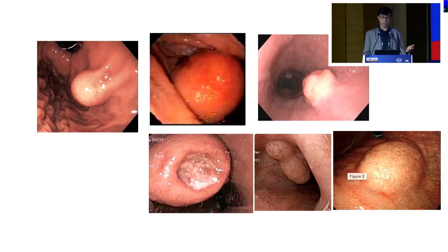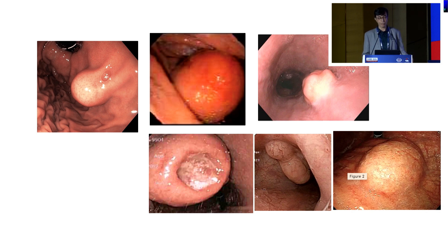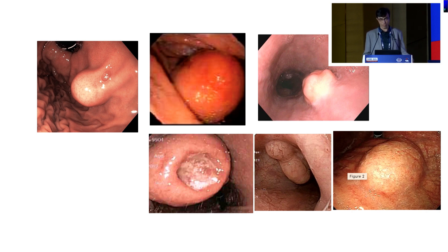There are other SELs shown in this photograph which you have to evaluate. The first one on the left looks like varices but was actually a GIST, and the bottom one on the right looks like an SEL on endoscopy but turned out to be a hepatic cyst compressing from outside. You can have a variety of manifestations of SELs, and in these cases you have to go further.